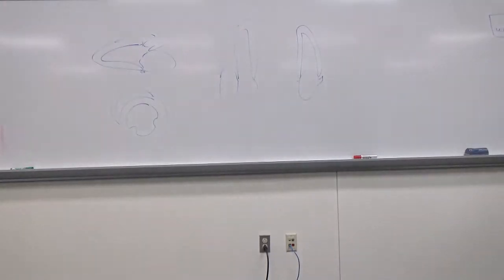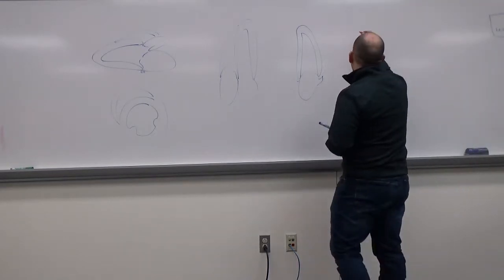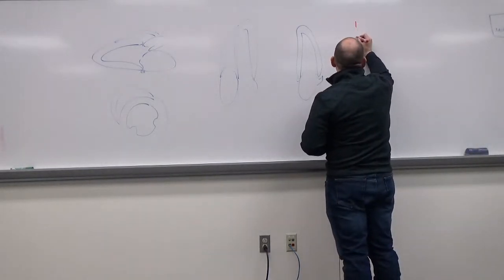What do you want to know about them? What do you think is the most important thing to know about the walls? If they're moving. If they're moving is absolutely correct. What else do we need to know about the walls? So you're going to look at the contractility. So as far as that stuff goes, you're looking at scoring them then, right?